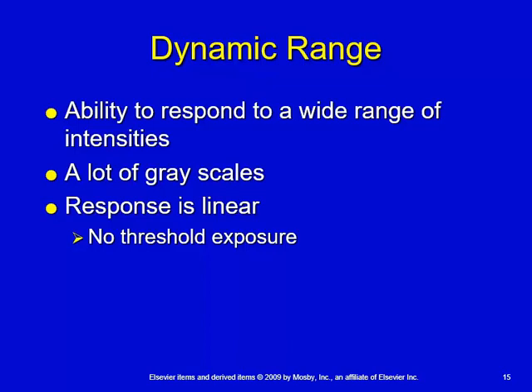So with the DR and the CR and the computer algorithm processing our image and giving us that wider dynamic range, what we can see is the low density areas and the high density areas on the same image. So we have wider dynamic range.